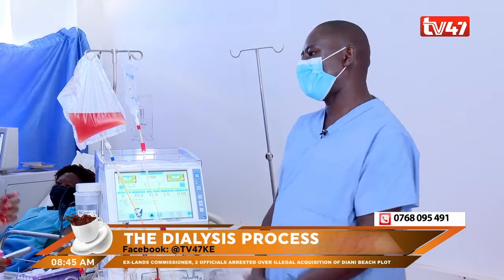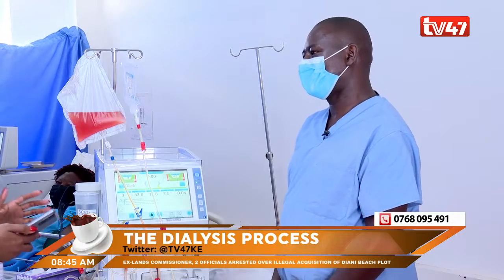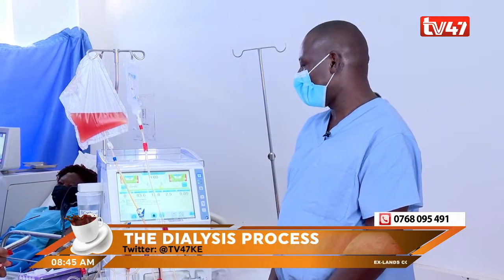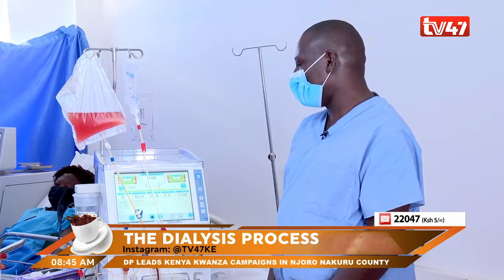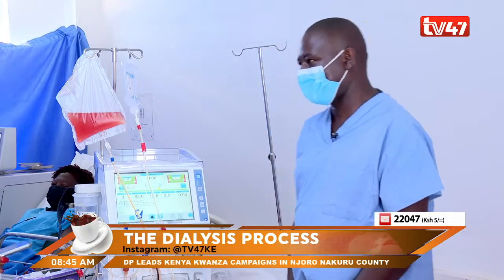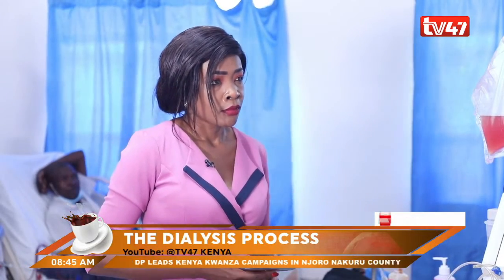So what exactly does it mean when you say that a patient is on dialysis? It means that the kidneys have failed, and that this is a treatment.